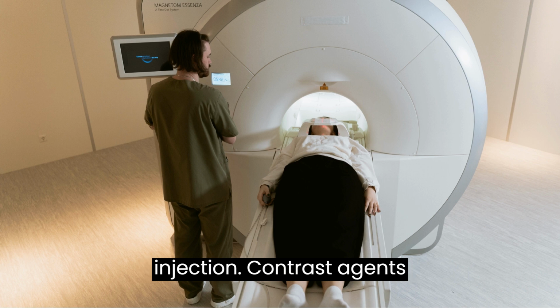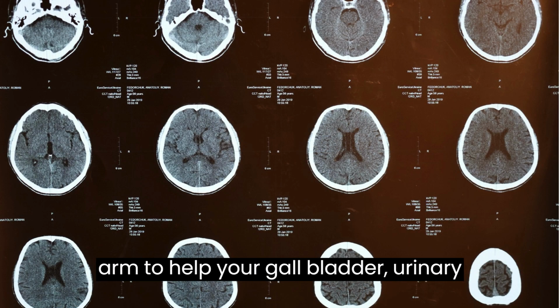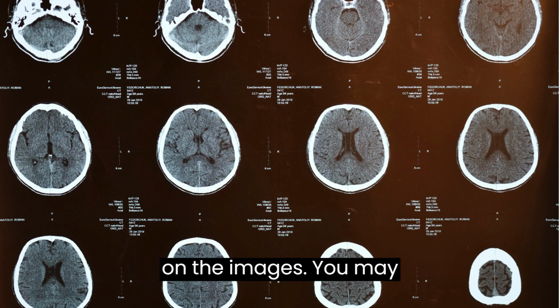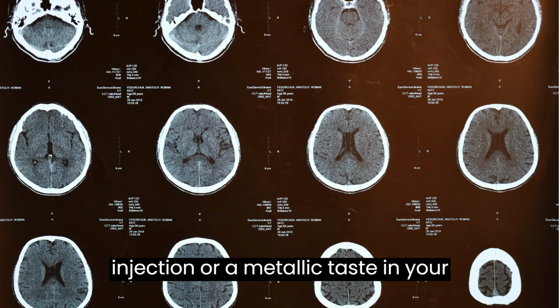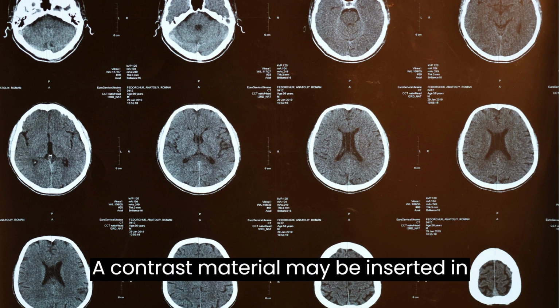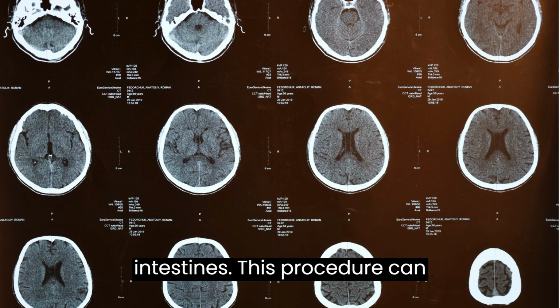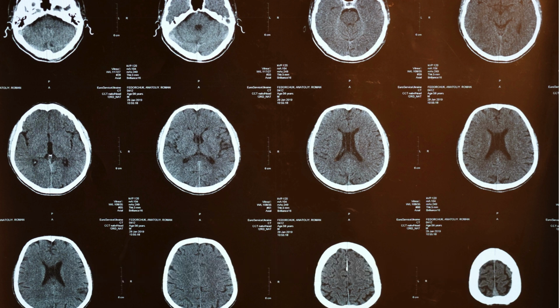By injection. Contrast agents can be injected through a vein in your arm to help your gallbladder, urinary tract, liver or blood vessels stand out on the images. You may experience a feeling of warmth during the injection or a metallic taste in your mouth. By enema. A contrast material may be inserted in your rectum to help visualize your intestines. This procedure can make you feel bloated and uncomfortable.